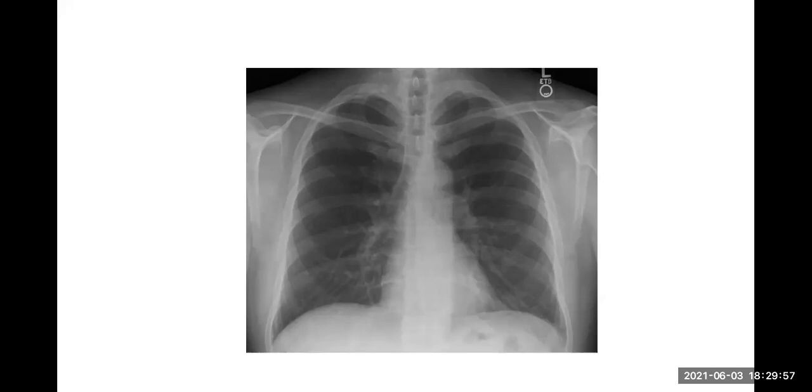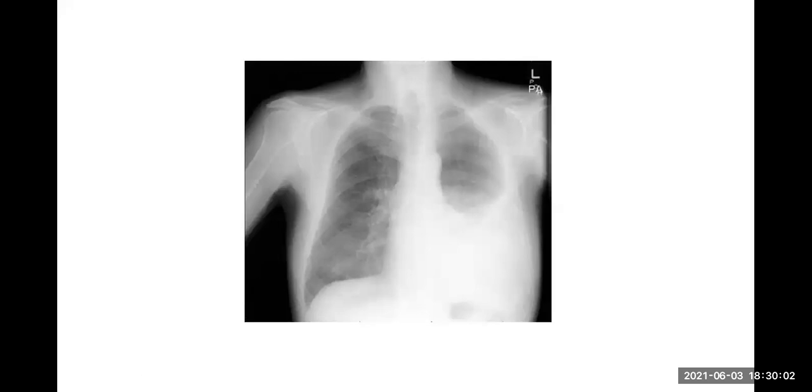So now let's start with abnormalities of the lung fields and air passages. Abnormalities are mostly in the lung fields. If you classify the radiological abnormalities on a chest X-ray, very easily you can classify it saying there are white lesions and there are black lesions. So we'll first focus our attention on white lesions. What are the white lesions that you see?